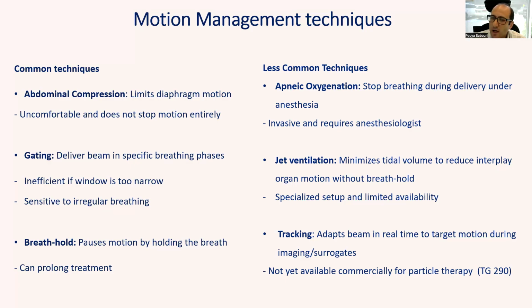On the right, you have less common techniques that I won't describe here. One of the more research-oriented techniques is tracking. It's a very elegant method that does offer, I think, the most adaptive option. But as TG290 reports, there is right now not a commercially available system for tracking. And in particle therapy, tracking does have significant complexities.